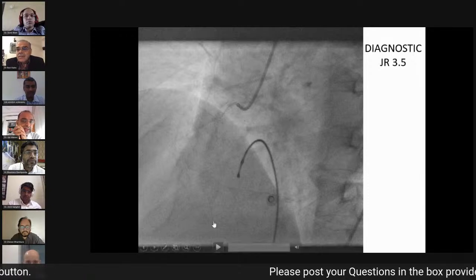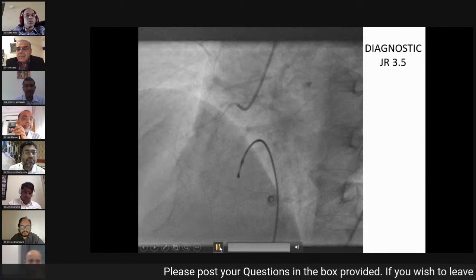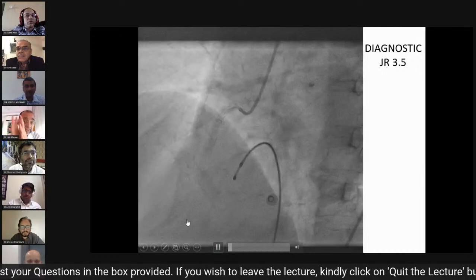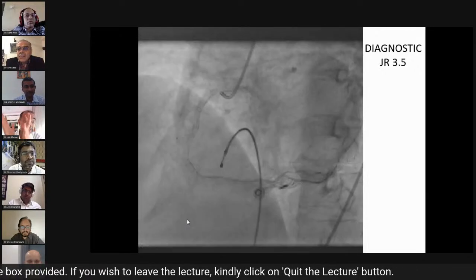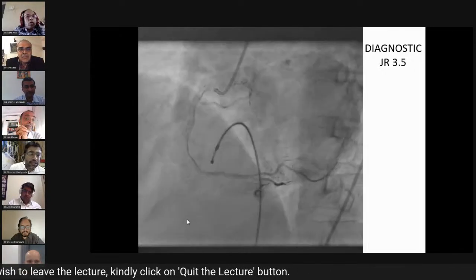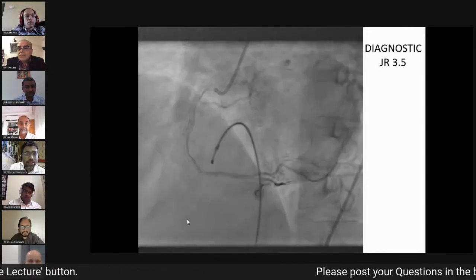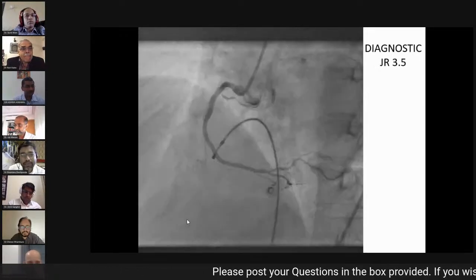The catheter can take only up to 80 pulses, so you have to change the balloon, change the thing again. But my guess is that if it doesn't open in those 80 pulses, you need to change your strategy. Yeah. Sir, I'll ask you one question. If you have to do this case, now you know the whole history and everything, how would you have done this case?